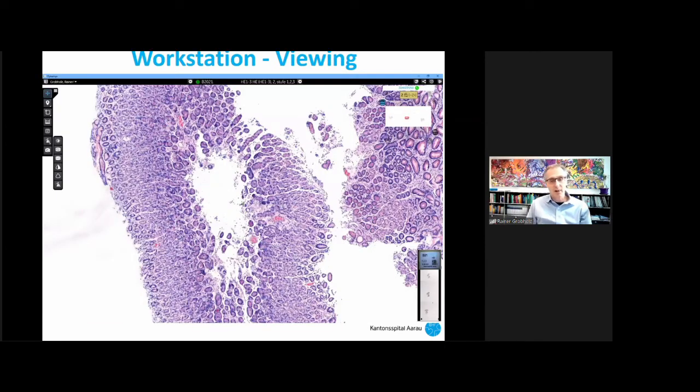And once you have your viewer, of course, you need some navigating window to see where your biopsies are located, and depending on the lab, how many step sections you might want to have on your slide. Are there 3 or 6 or even more, or is it just one? And also you need a control, an image snapshot of your slide, that gives you the information whether everything is scanned, and you can compare it over here that everything is scanned.